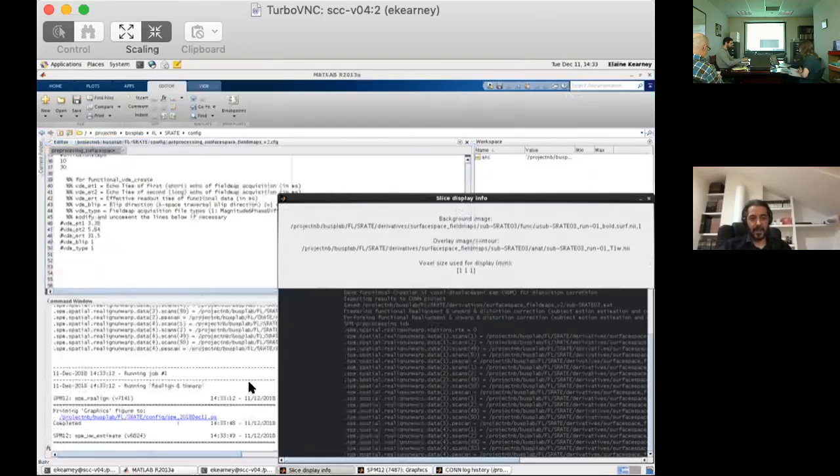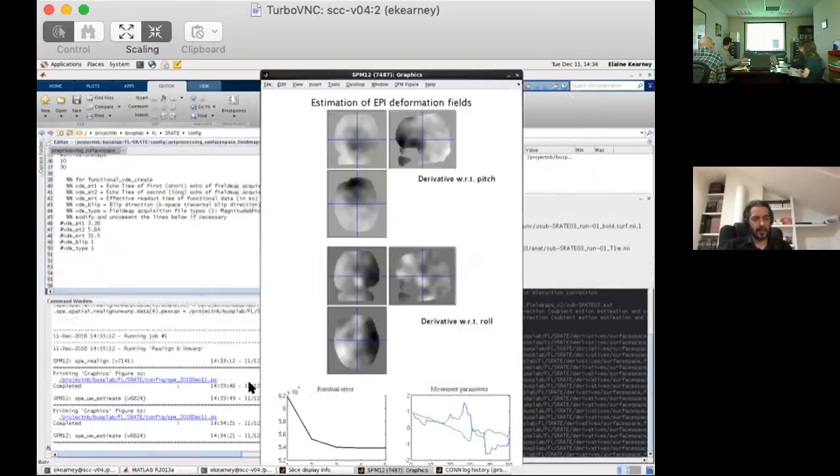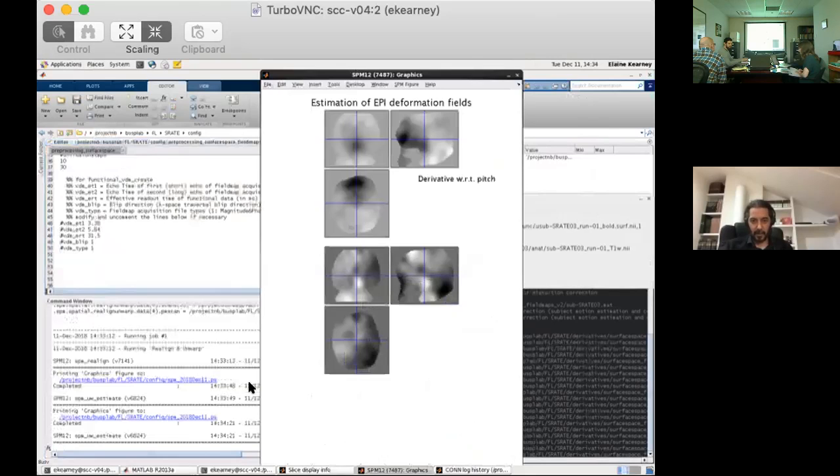So I don't know. If any of you have run into this information, I would be very happy to hear about it, because I've been trying to dig it up myself and couldn't. So currently I'm using this convention: if phase encoding direction is J minus, I'm transforming that to the blip directionality, which in SPM convention is called the K space traversal blip directionality field, which can be positive or negative. So I'm taking J minus to be negative and J plus to be positive, but I would definitely like a little more confidence about that.